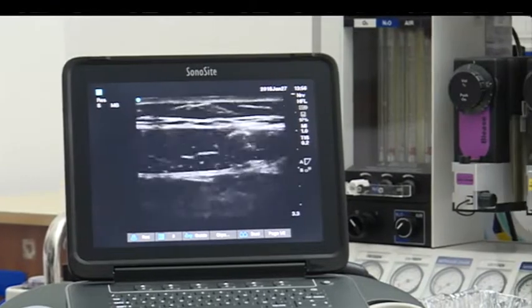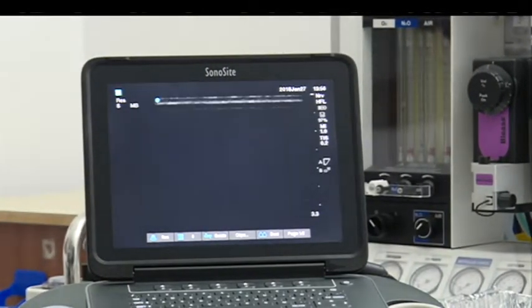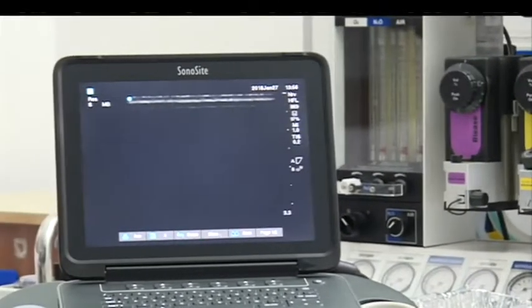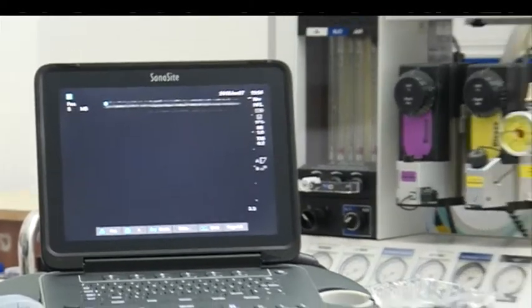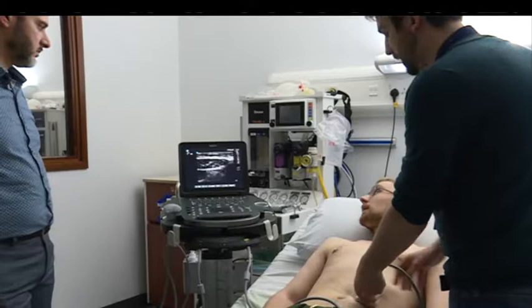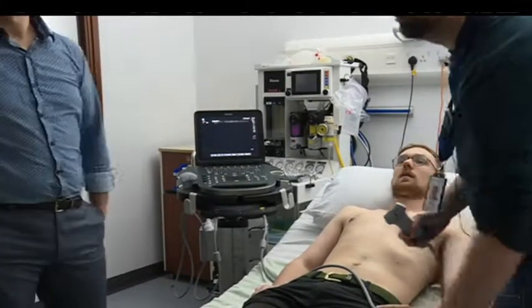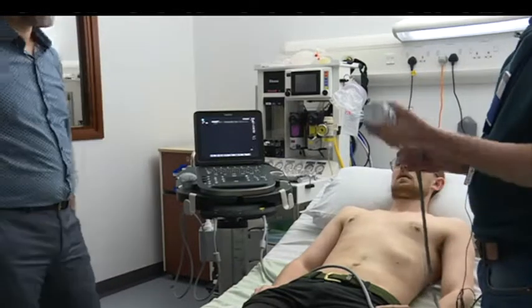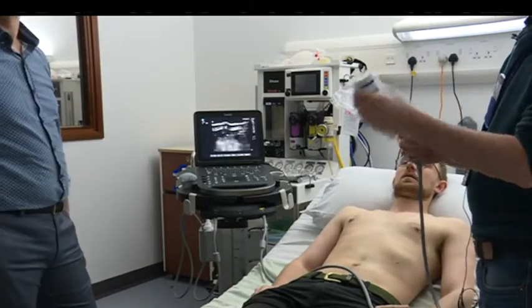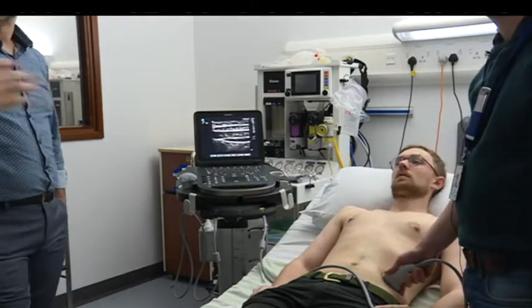I would do it above the umbilicus — you can see the rectus below the umbilicus, but the sheath is not necessarily continuous below it, so it's best to place it above. Now the next thing we're going to do is follow it round to the abdominal muscles, which you'll all know because you'll have done TAP blocks — they are technically difficult.